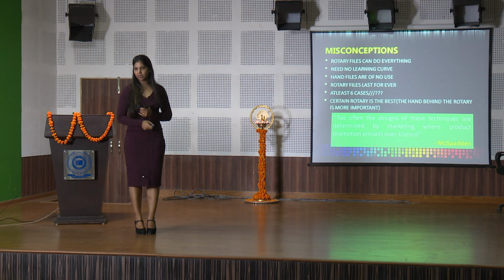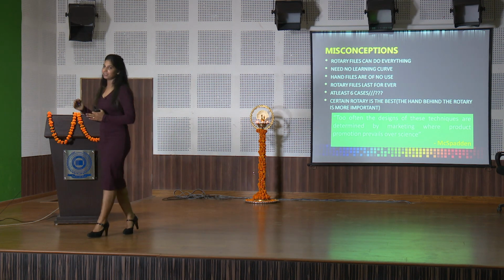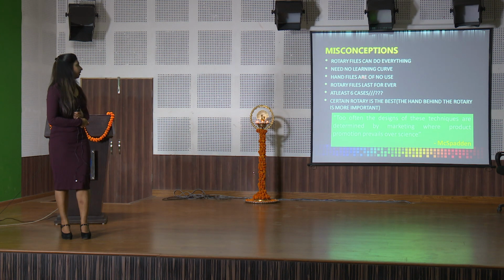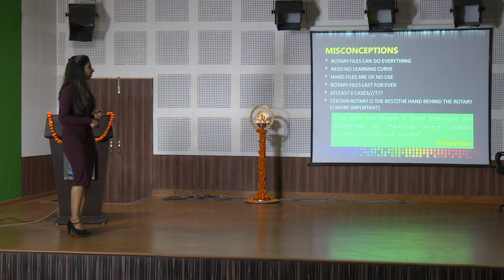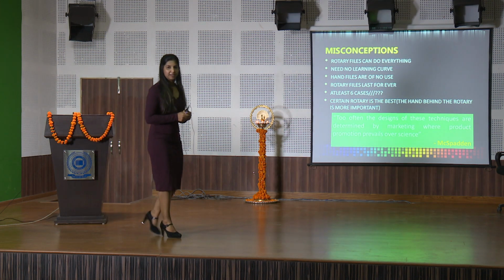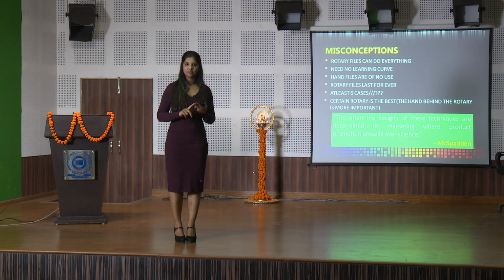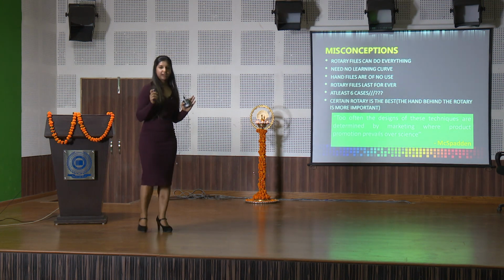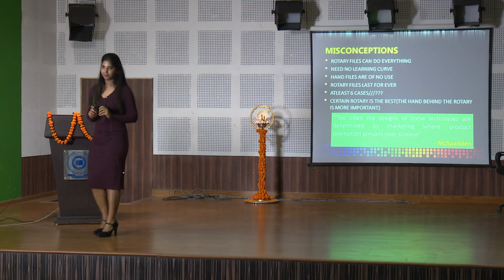They do need a learning curve, although the learning curve is not as large as we have for operating microscopes, but there is definitely a learning curve. Hand files are indispensable. They are supposed to be in your armamentarium. Rotary files last forever, or is there a magic number? Alas, there is no magic number. It can last one case, it can last 10 cases. So whichever company, whichever file claims that our file lasts for this many cases, it's a myth.